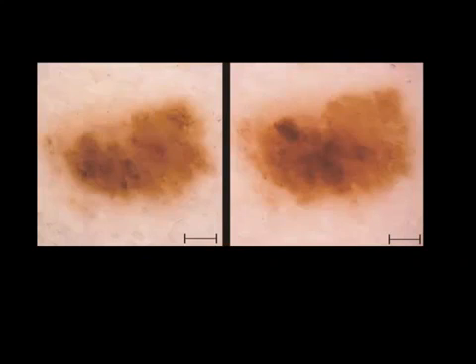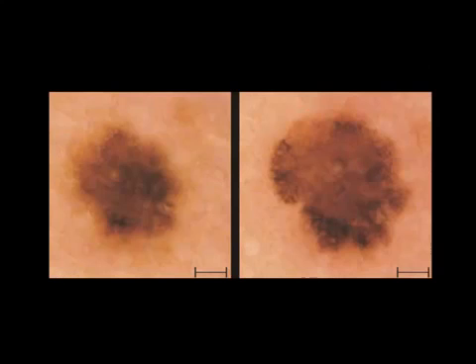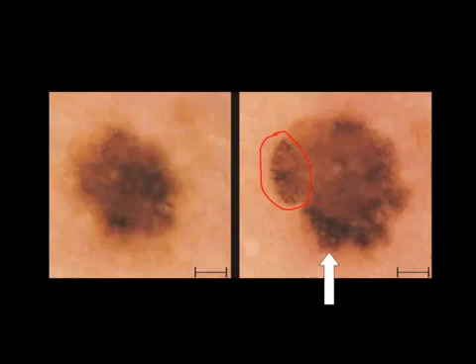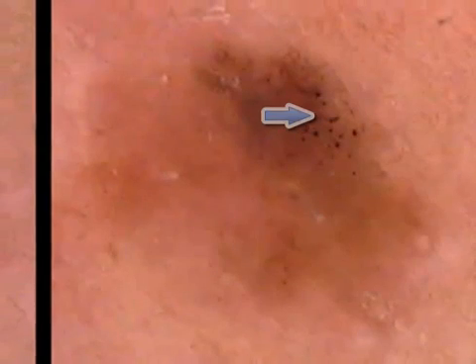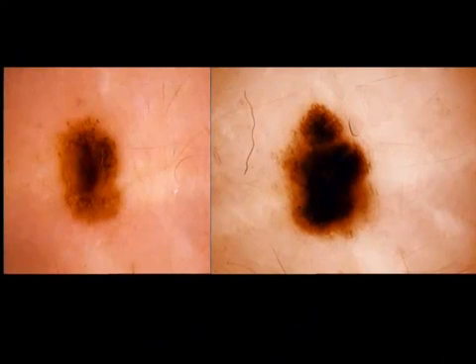Here's another example: left is the first visit, right is the follow-up visit, and you can see a new structure appearing — black dots at the periphery — and this also turned out to be a melanoma in situ. Another example: a melanoma that didn't increase in size, but a new structure appeared — black dots at the periphery — melanoma in situ. Another very small lesion looks like a nevus, but at follow-up there are black dots at the periphery — melanoma in situ. Another very small lesion with an asymmetric increase in size — melanoma.